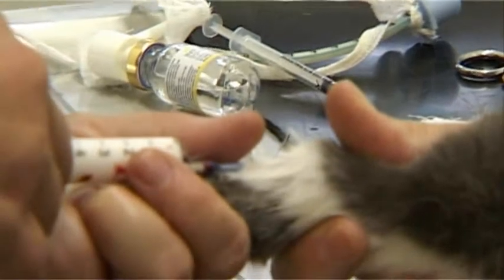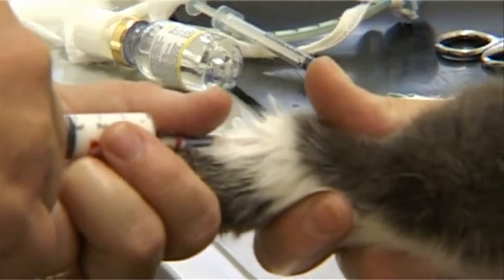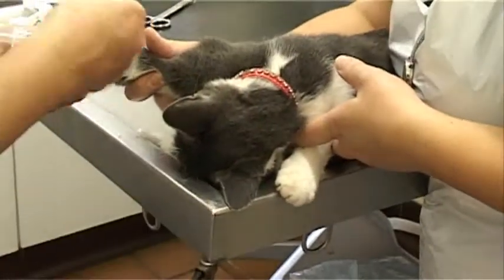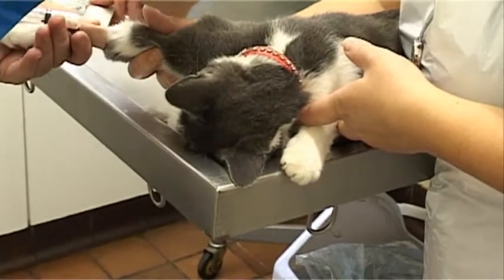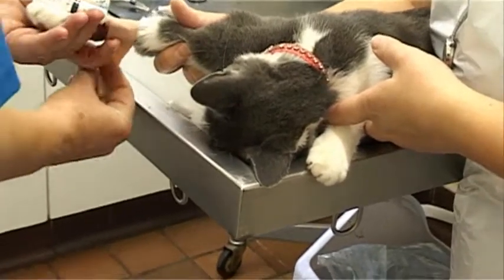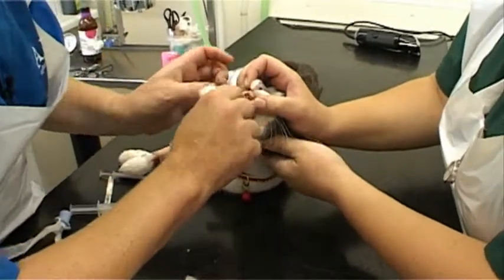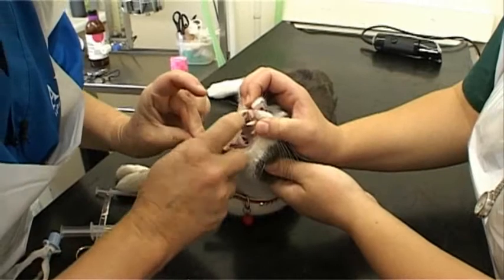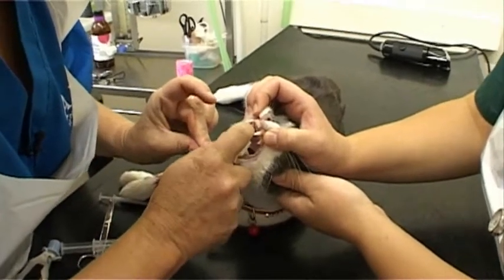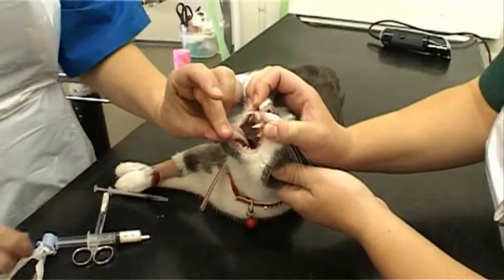Okay. Good girl. You go off to sleep, Poppet. That's Macy asleep. Let's just strap that in case we need a vein for anything later. We'll need to give her any more. Macy's just over a year old so far as we know. She had a litter of kittens 12 weeks ago. That's a local anaesthetic.